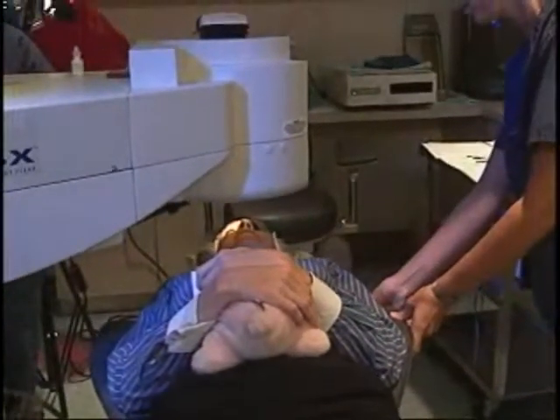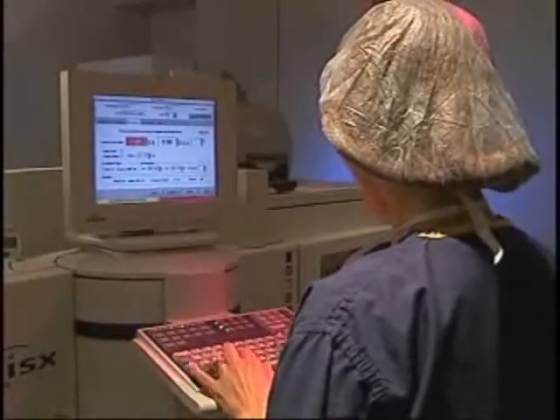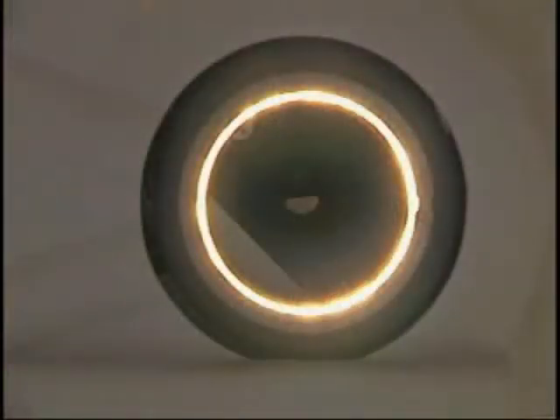After hearing the sounds of the laser during an initial test, your eyelashes are taped and an eyelid holder called the speculum is inserted to prevent blinking. You will next be asked to focus on the blinking light located above you in the opening of the laser. Marks are typically placed on the eye to facilitate the exact repositioning of the flap.